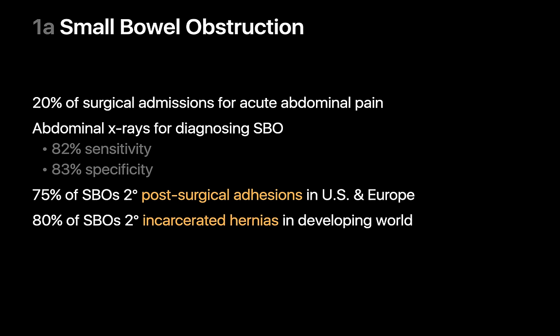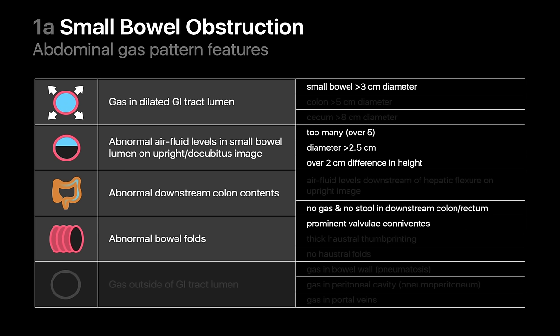Adhesions from prior abdominal surgery are the most common cause of small bowel obstructions in places like North America and Europe, while in low-income countries the most common cause is incarcerated hernias. Abnormal abdominal gas patterns that may occur in a small bowel obstruction include distended small bowel loops over 3 centimeters in diameter. The colon and any small bowel downstream of the obstruction site will usually be collapsed, resulting in a paucity of distal gas. Air-fluid levels may occur in small bowel upstream from the obstruction, and abnormally thickened valvulae conniventes may be present, resulting in a stack-of-coins appearance.